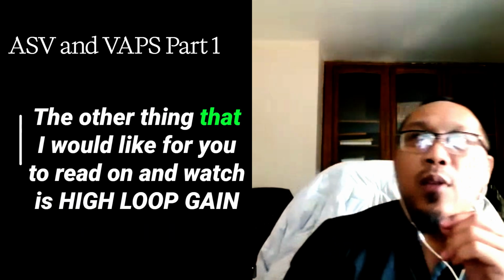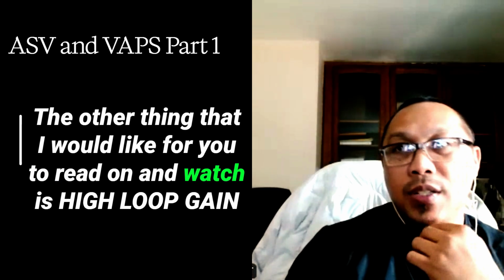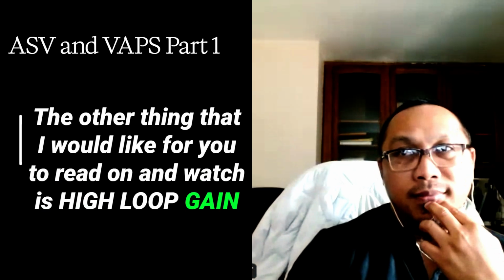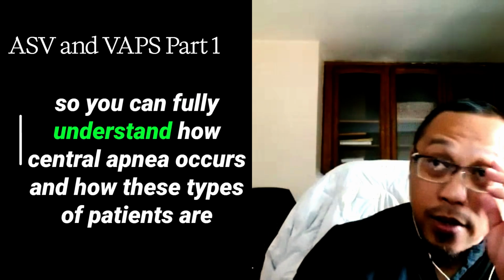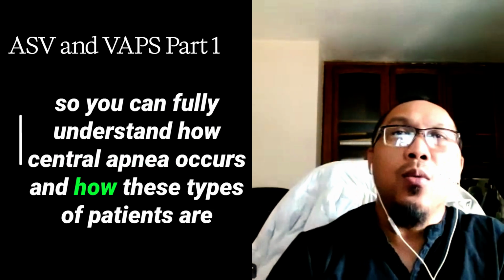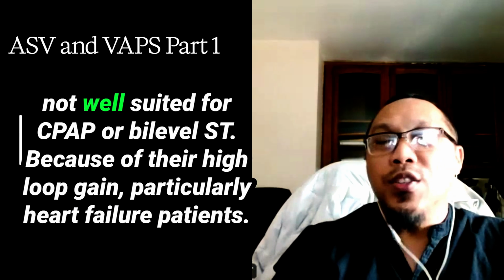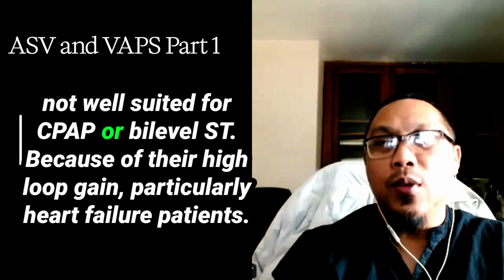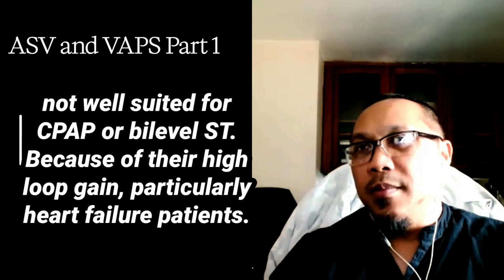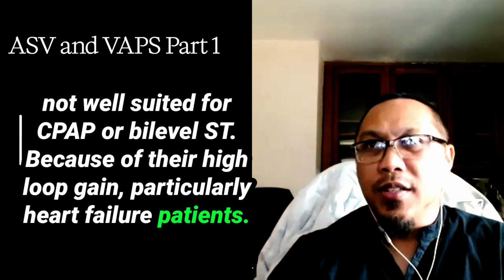The other thing that I would like for you to read on and watch is high loop gain. So you can fully understand how central apnea occurs and how these types of patients are not well suited for CPAP or bilevel ST because of their high loop gain, particularly heart failure patients.